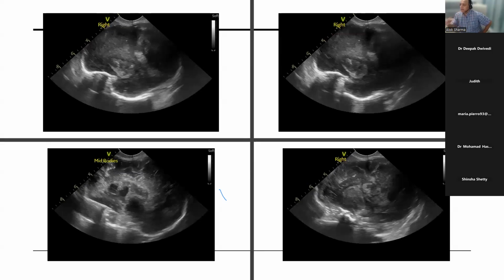Again, so just the right side, you see a lot of hyperechogenic areas. You're getting kind of the Sylvian fissure, but really there's no anatomy defined. This is very severe, to the point where actually the meninges have dropped back. This is an area of necrosis that you see over here. This is not an easy scan, so I'm basically going through with it.